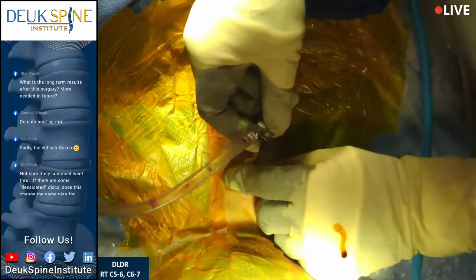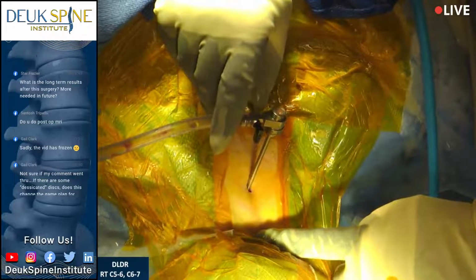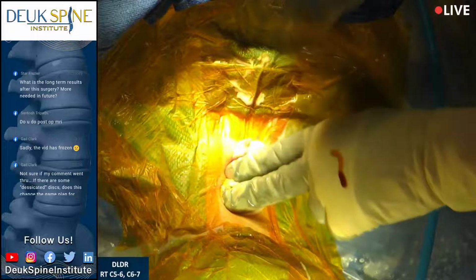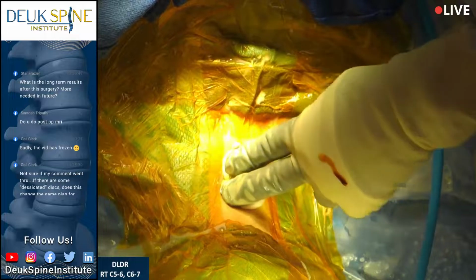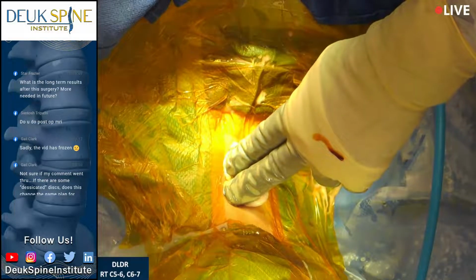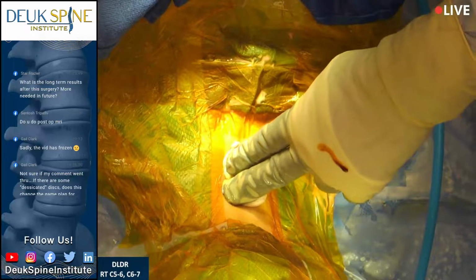All right, can you see this, Flynn? I hope you can. I'm going to show you the tube here. It doesn't want to come off. That's good, though. We'll keep it on. All right, tiny little incision. It's 4 millimeters. We're going to take this tube out because we're done. Literally just pull it out of the disc. I'm going to apply pressure in case there's a little venous bleeding. We never have arterial bleeding because we're not entering an artery. And sometimes you'll get a little vein that gets torn during the surgery. Most of the time we don't have any veins. But you want to apply pressure for a couple of minutes in case you have some venous ooze.